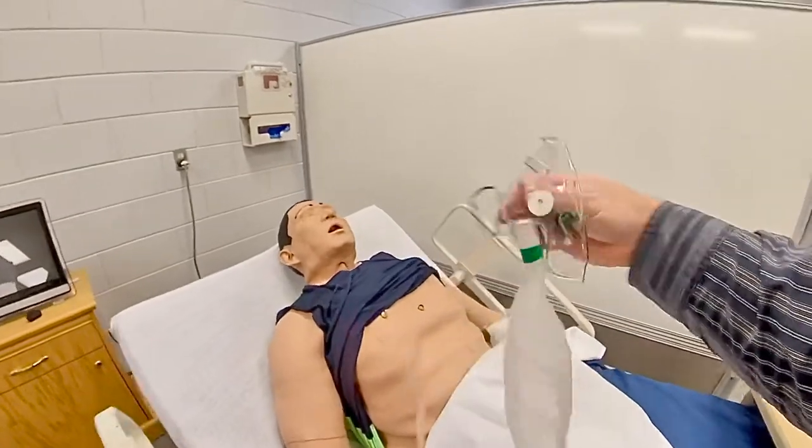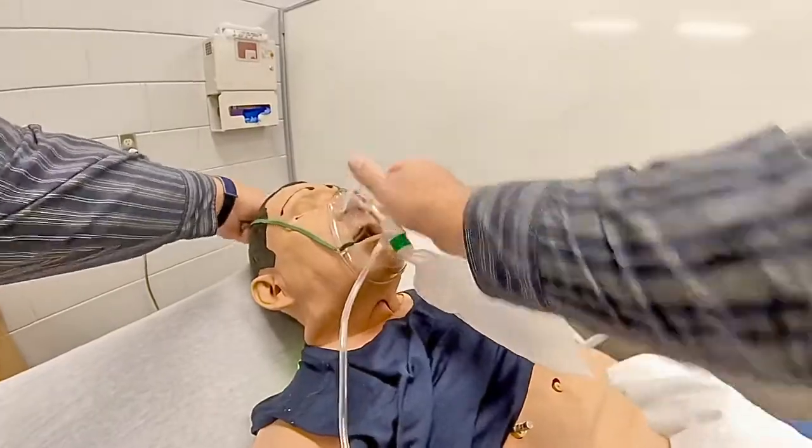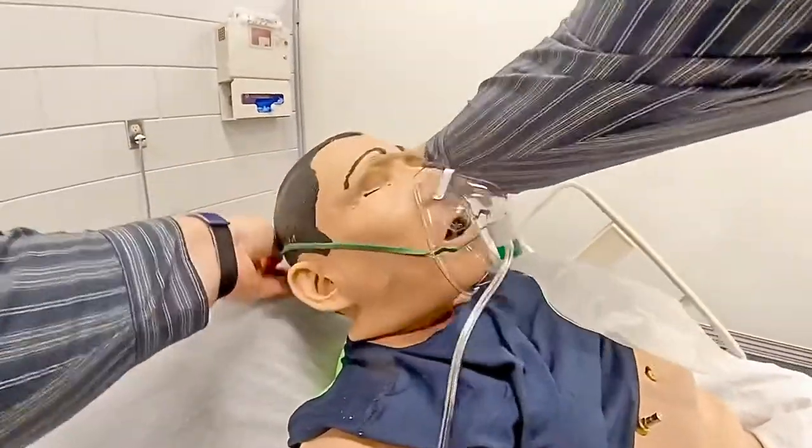Now that it's inflated and the oxygen is running, I can put it on my patient and pull the straps behind the head.